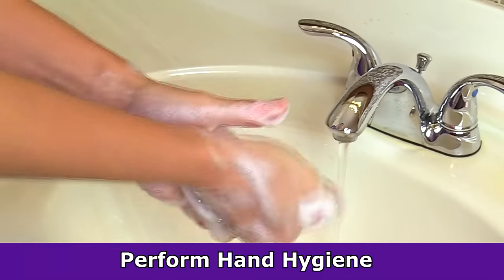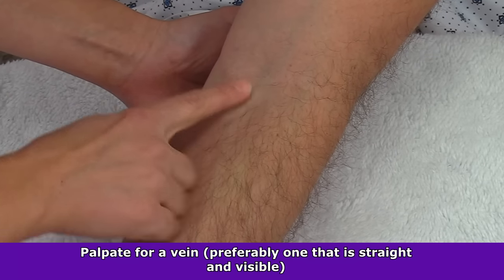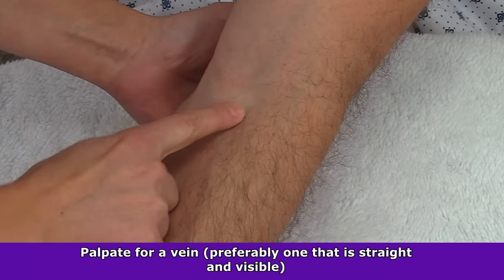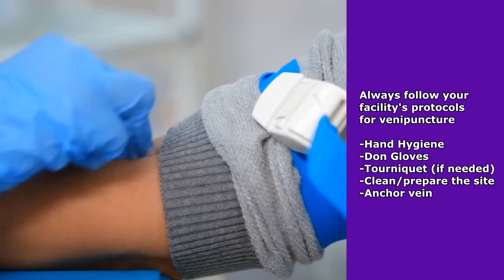However, you always want to anchor every vein before you stick it. Before anchoring, always perform hand hygiene. Next, palpate for a vein to penetrate — ideally go for a straight vein that is easily visible. Properly prepare the site and follow your facility's protocols for anchoring veins.